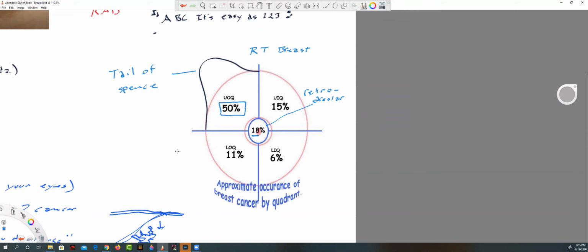So let's see, I'm going to quick look at my notes. Patient, rolled, sag trans, rad, arad, quadrants, and axilla. Okay, yeah, now let me just add that one little thing, not a big deal at all.